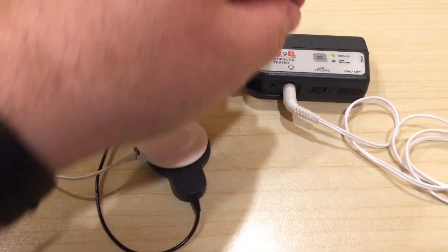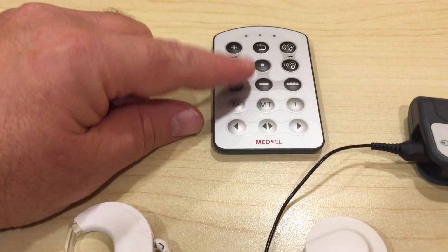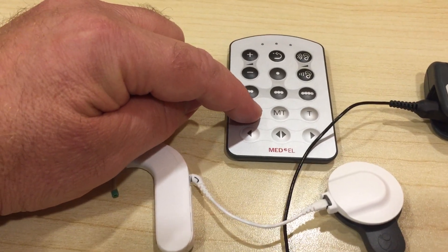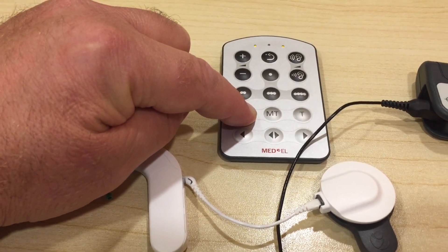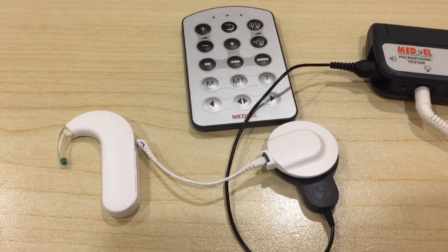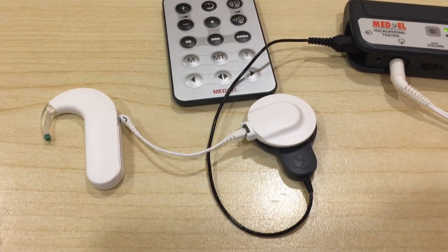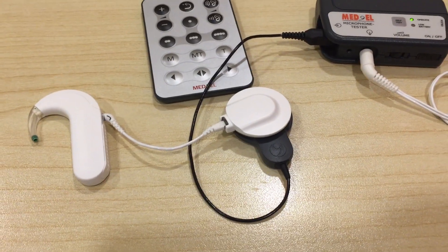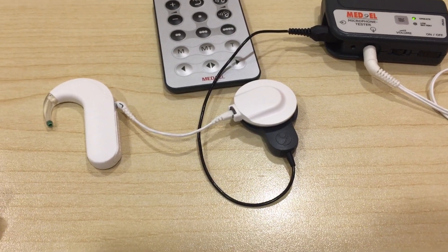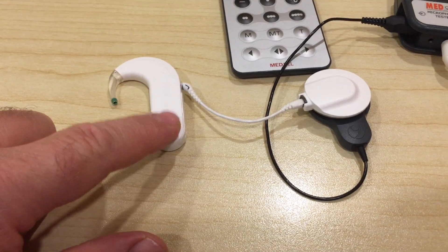Next, go over to the fine tuner and press and hold for about three seconds the M button. As you're listening to the microphone test device, you'll hear a beep acknowledging that it is in listening mode, and now you should be hearing a nice clean microphone.